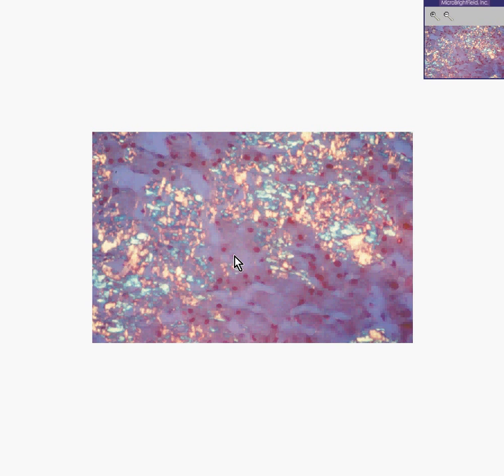Bingo! We have some spectacular polarization patterns. We have brilliant yellow, but even more importantly, we have this granny apple green birefringence. Not just yellow birefringence, but granny apple green or apple green birefringence.